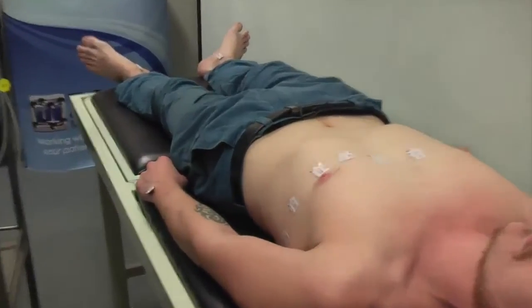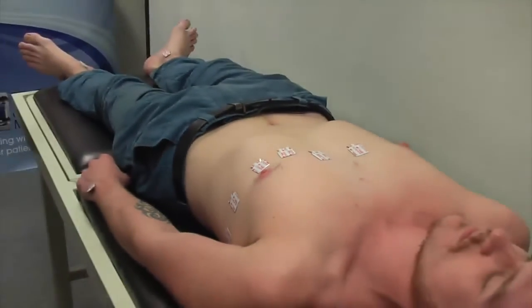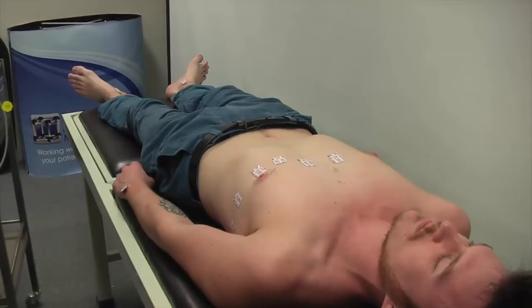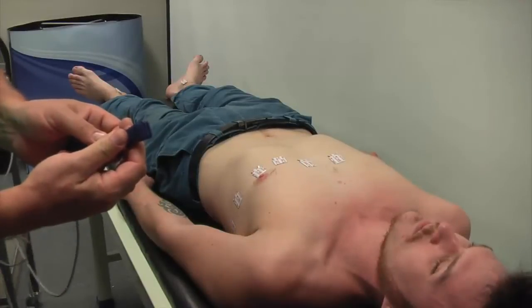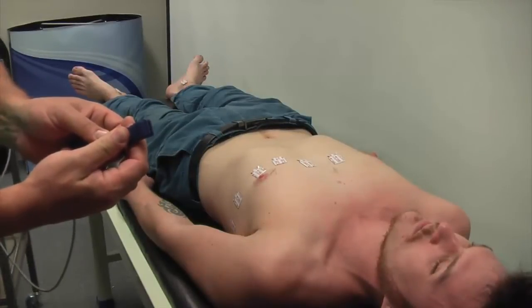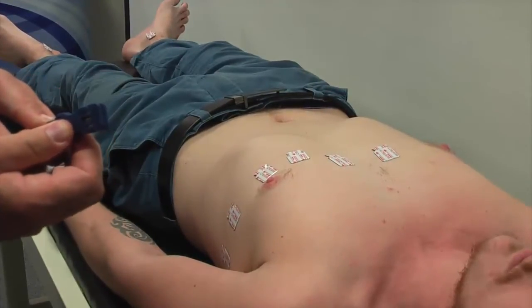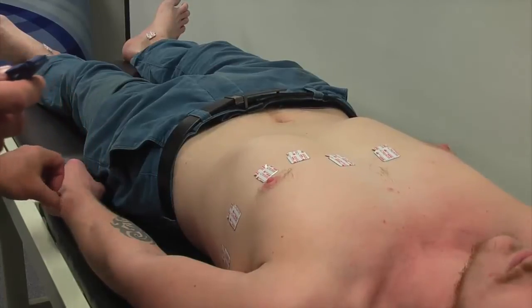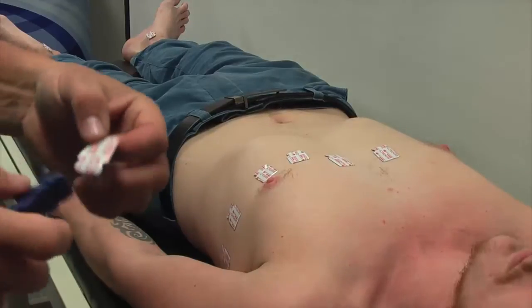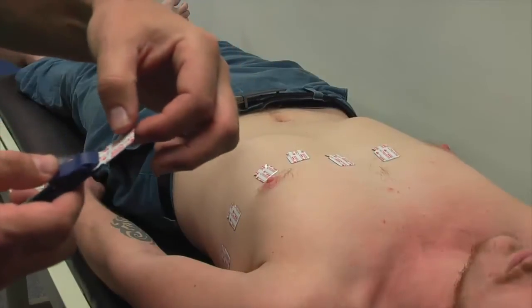Already we can see some of the electrodes are starting to peel off, so we're obviously not going to get a really good quality trace connecting those as they currently are. When using the alligator clips, you'll notice that one side of the clip has a piece of metal for conducting — one side may not, although some alligator clips do have conduction on both sides. That metal side must be in contact with the ECG tabs, not the plastic upper surface.